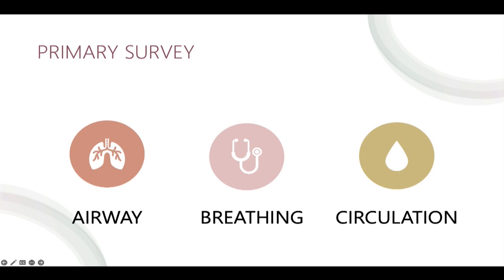So two best ways to do so here. One, EKG, we want to know what her heart is doing. And two, bedside ultrasound. We have a patient that has a history of cancer, has been minimally active, is pretty much hemodynamically unstable. So we want to see what's causing her state of shock in this case. And one of the best ways to do this is doing a bedside ultrasound of the heart.